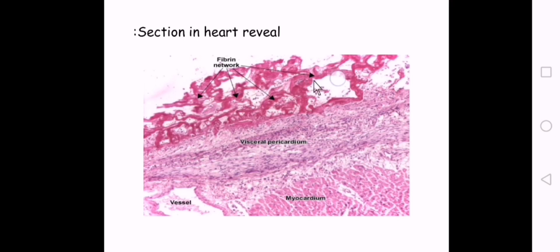هاي شنو البينك ماتيريال اللي على السيرفيس of the pericardium؟ هي هاي الفايبرين threads. الفايبرين threads appear either as a eosinophilic network of threads، or ممكن واحد يوصفها as يعني coagulated dark eosinophilic masses. The underlying myocardium is normal with no change. أكو few dilated thin-walled blood vessels.